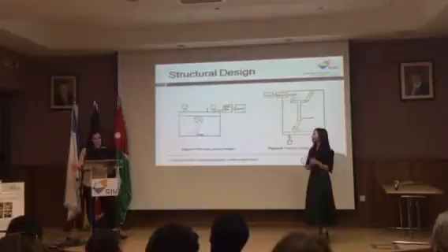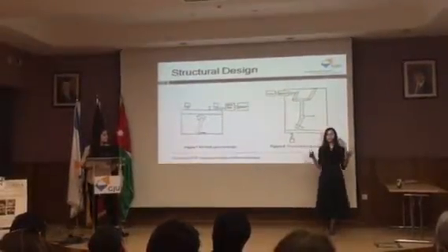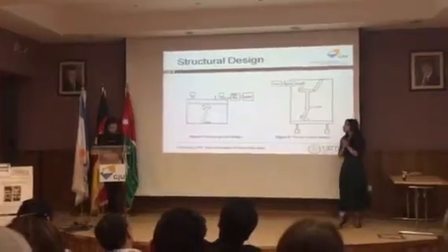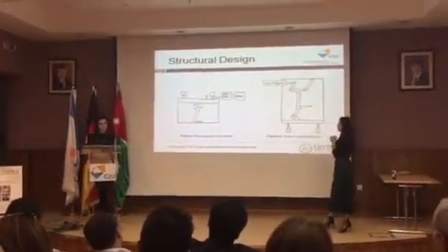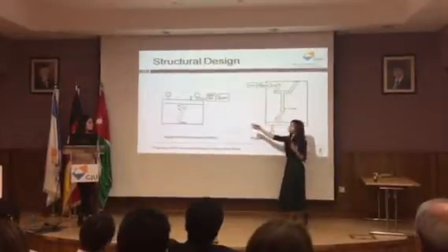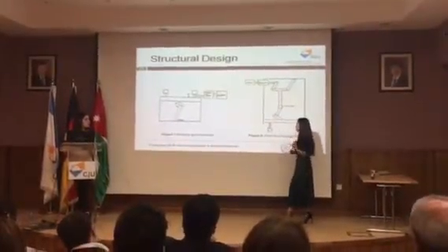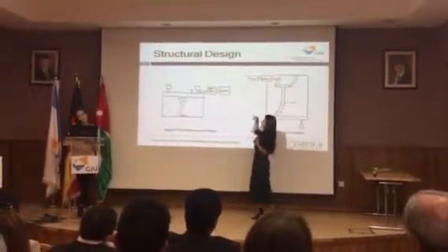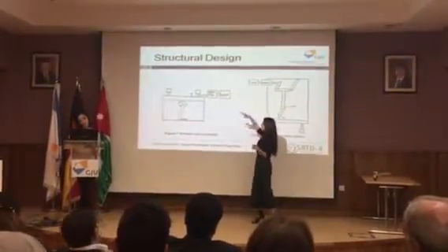And so here we have the two main concept designs that we came up with for the structure. The first one is a movable ground design, and in this design, as you can see, there are fewer components than the design shown in figure 8. In this design we have the knee component. The distinctive feature here is a movable platform.